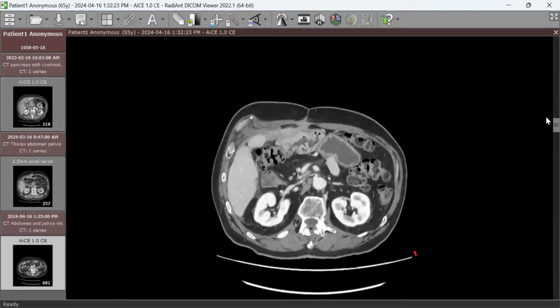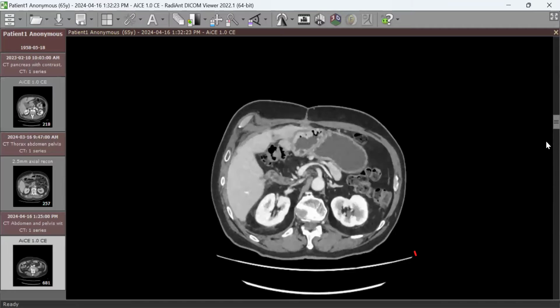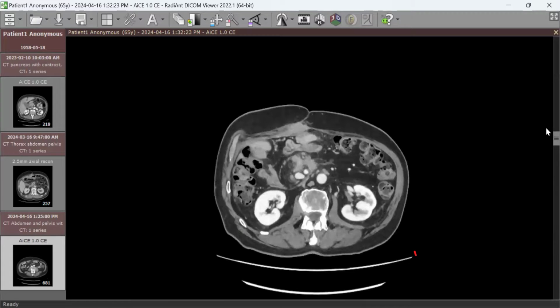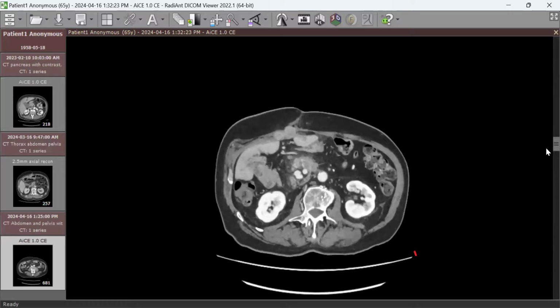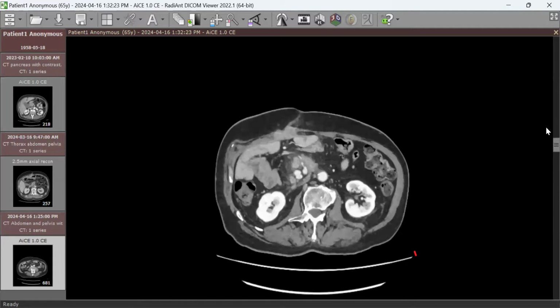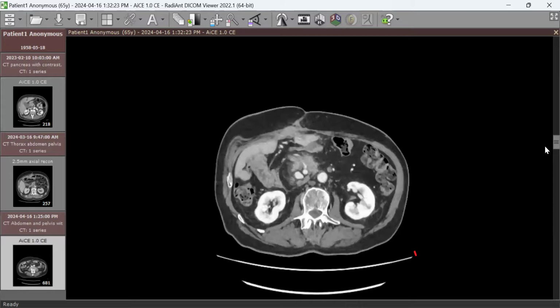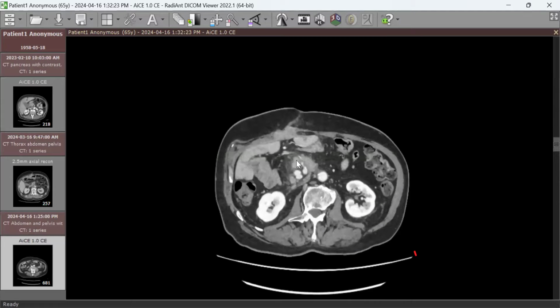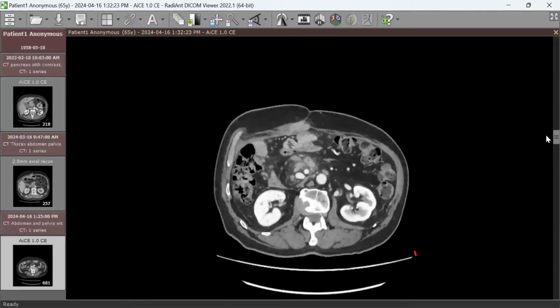Now, after Whipple's procedure, what's happening to the patient? Is he completely treated? What's going on here in this area? The narrowing, the first part of the narrowing. These lesions. We agreed that we removed the duodenum, most of it. Okay.